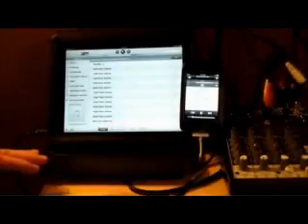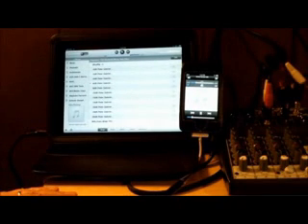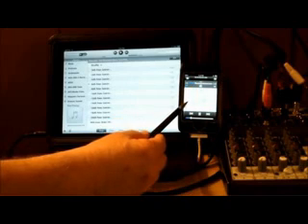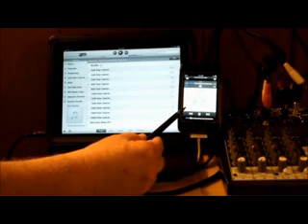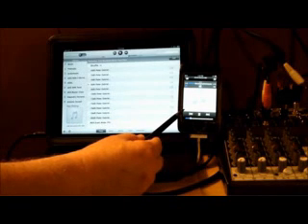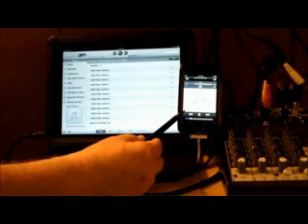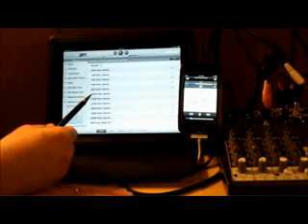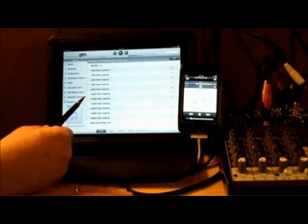Here we see the electrical setup that's going to be used to create our test signal and detector for the Stapedius measurement. Detection of the volume change will come from a tone that's being played by this device, which is at about 230 Hertz, and as the volume level changes within the trapped volume, we'll be able to make that determination. This will play the excitation signal designed to stimulate the Stapedius reflex.